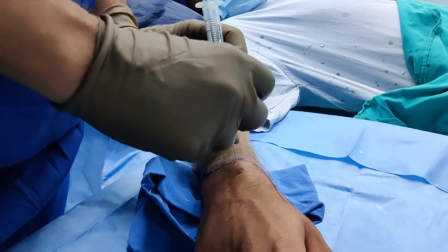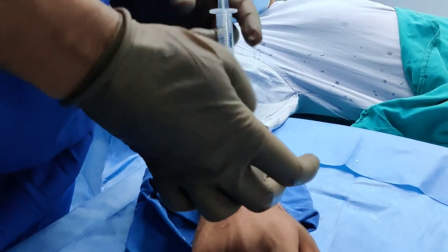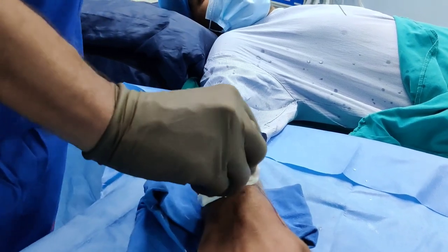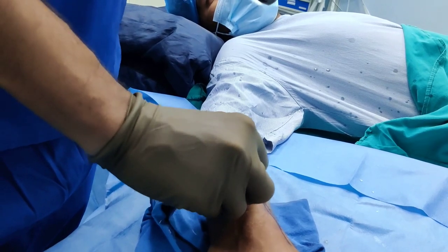Once you have injected everything, keep the pressure on, close the tap, and then withdraw the needle. This is how you either inject or aspirate a wrist joint.